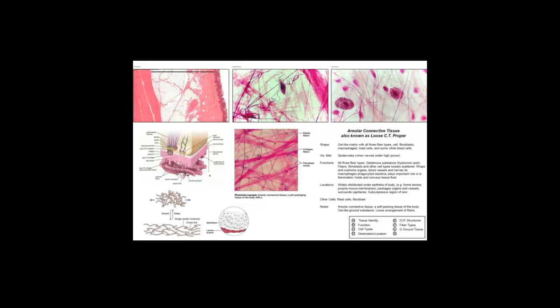These are both larger cells, mast cells, releasing histamine and heparin, involved in the inflammatory response and in thinning of the blood during that increased flow of blood throughout the body, which would be the first response for any tissue repair or damage in the body. This circular cell is a white blood cell or leukocyte, and we'd also potentially find in this particular slide larger macrophages and fat cells as well as plasma cells from the blood that's circulating through it.